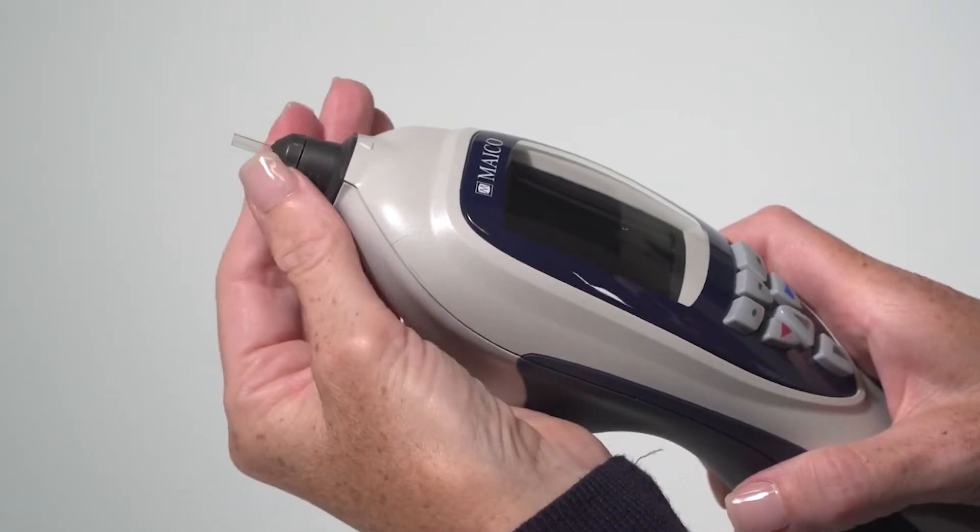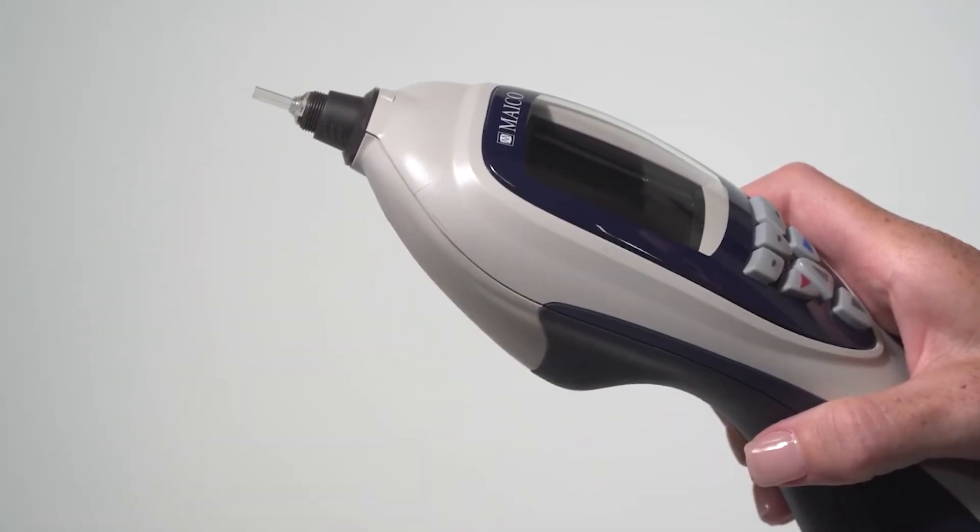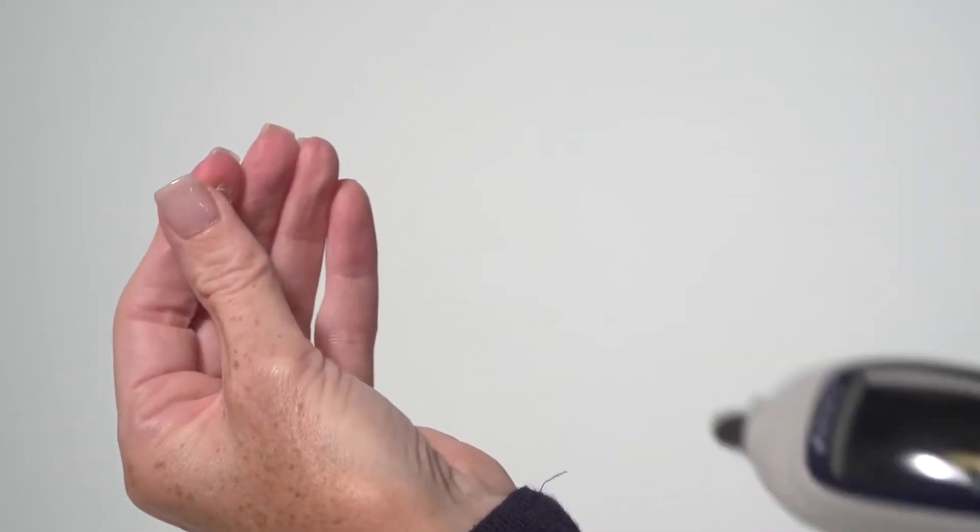To clean the probe tube, start by turning the probe cap in a counterclockwise direction. Never clean the probe tube while still attached to the probe. Take the plastic probe tube out of the probe.